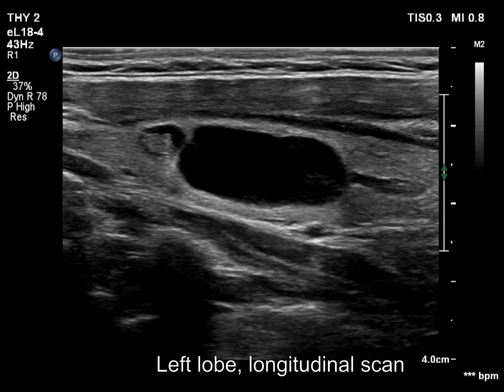We can see a characteristic phenomenon: the acoustic amplification dorsal to the cyst. That is, the thyroid dorsal to the cyst appears lighter compared to other parts.